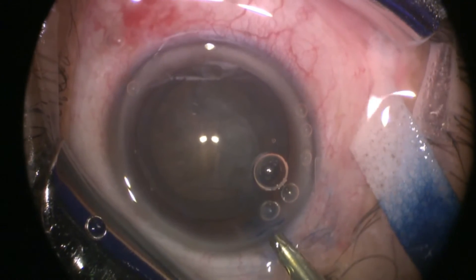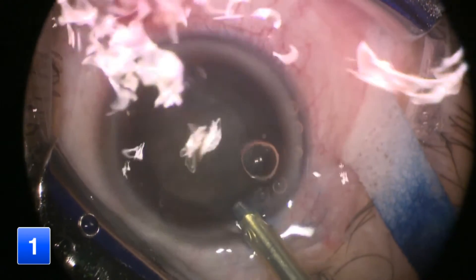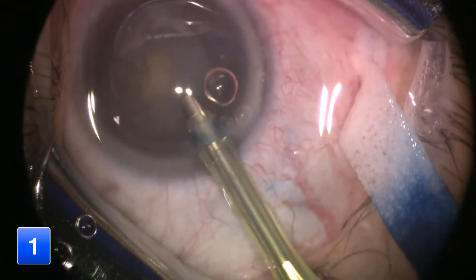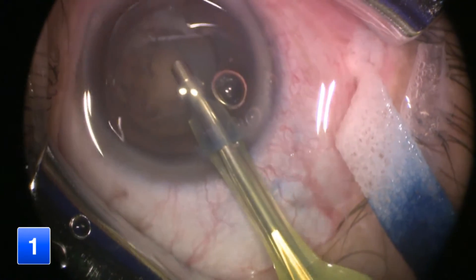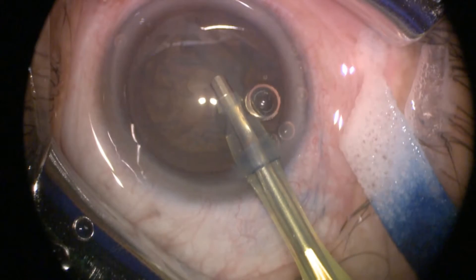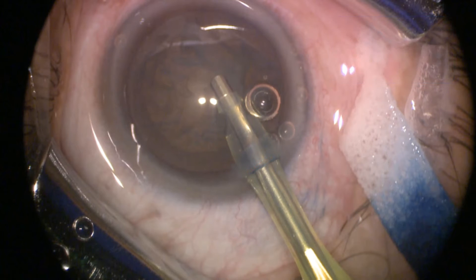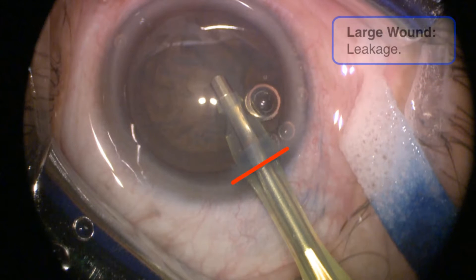While inserting the FACO probe into the eye, make sure that your FACO probe is on irrigation only, as any aspiration or ultrasound will damage your corneal wound. After inserting the probe, make sure that the sleeve perfectly fits the width of your wound. A wound that is too tight may limit your movement and increase the risk of a wound burn. On the other hand, a wound that is larger than the width of the probe will be leaky, leading to an unstable chamber during emulsification.